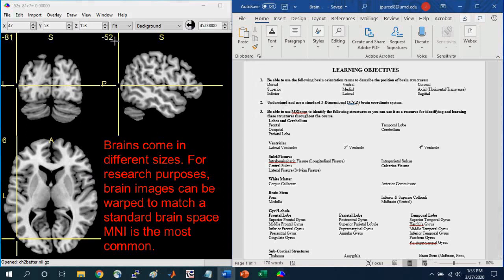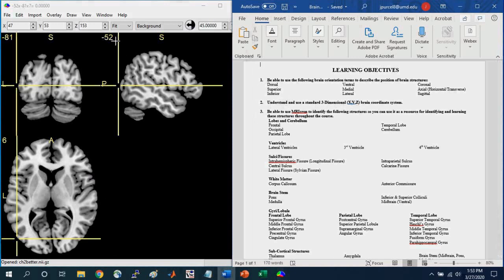And the specific brain space we're talking about is MNI space, Montreal Neurological Institute space. So this is a standard coordinate system used all over the world, such that if somebody on the other side of the planet is working in MNI space and gives me a coordinate, I know exactly what part of the brain they are looking at.